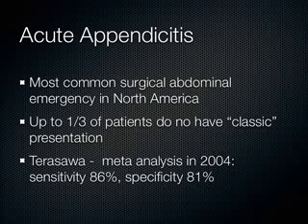risk. Now, if we could get good with ultrasound, though, and see a true appendicitis on ultrasound, we could avoid the need for a CT scan, and especially in a younger patient. The average age of somebody who gets appendicitis is 27 years old.